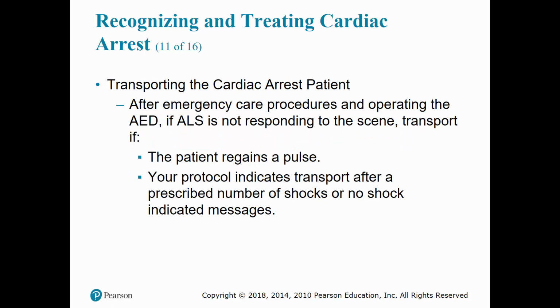Alright, transporting a cardiac arrest patient. After emergency care procedures and operation of the AED, if ALS is not responding to the scene, transport. The patient regains a pulse. Your protocols indicate transport after a prescribed number of shocks or a no shock indicated message.